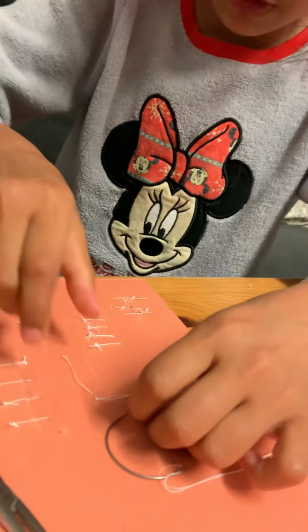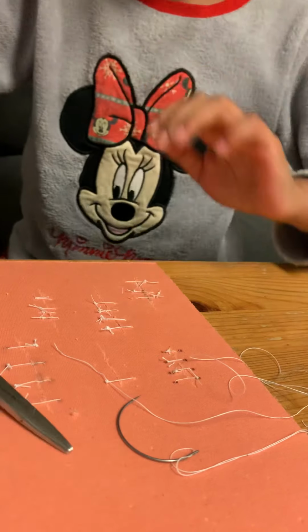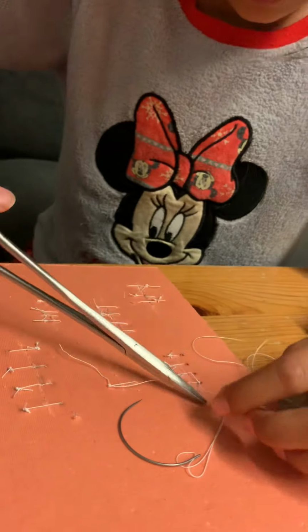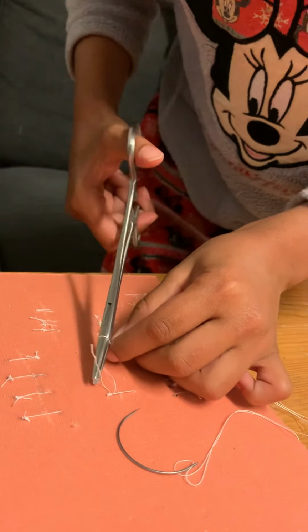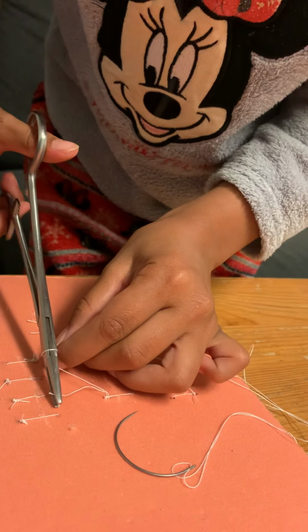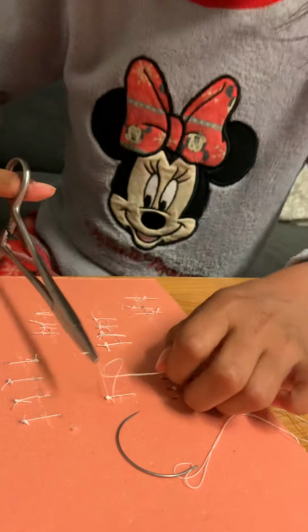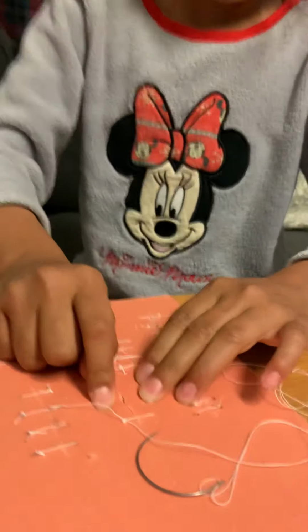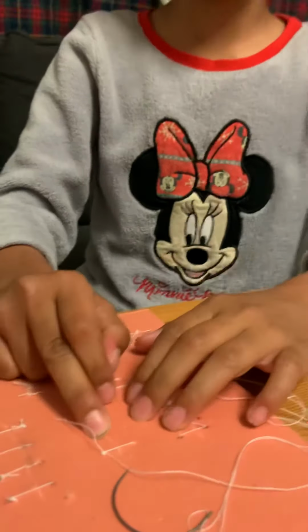And then if it doesn't pull as hard as you expect, you could use your hands for a small moment. And now, as I was saying before, you could get the one and one. And the very, very edge of it. And there. So now, as you can see, there's a full stitch there.